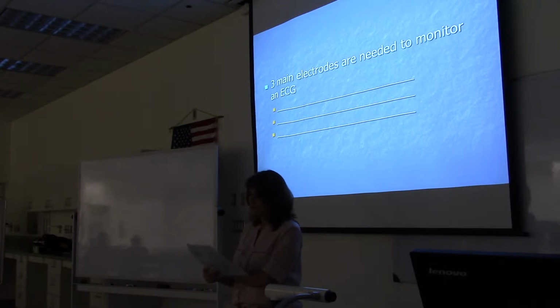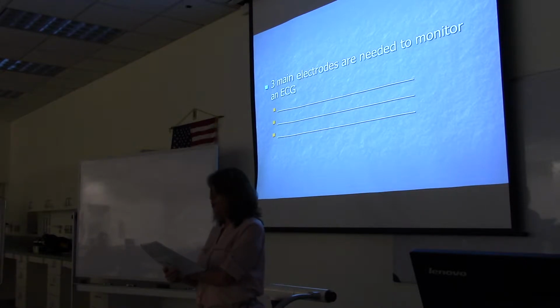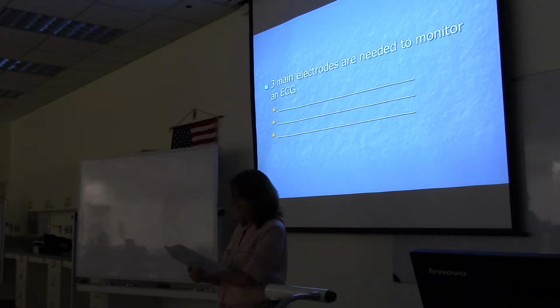On the next line, put positive. Place on left leg or lower left ribs anteriorly.